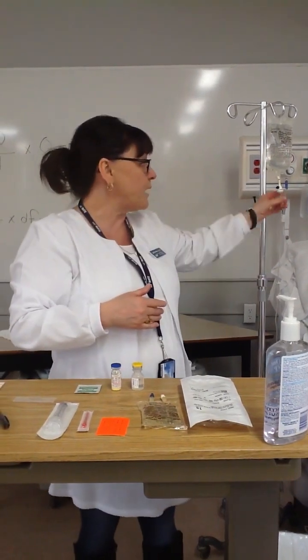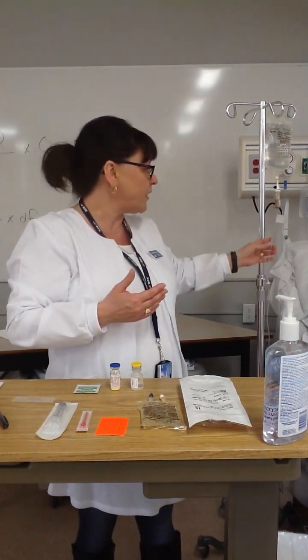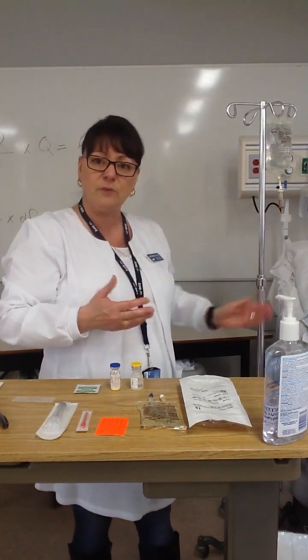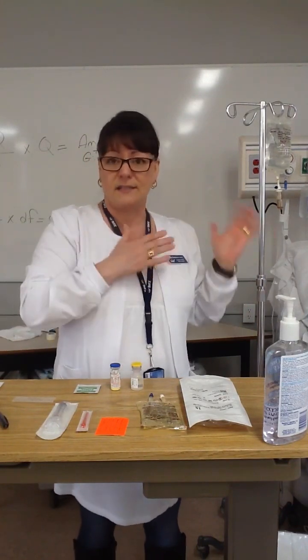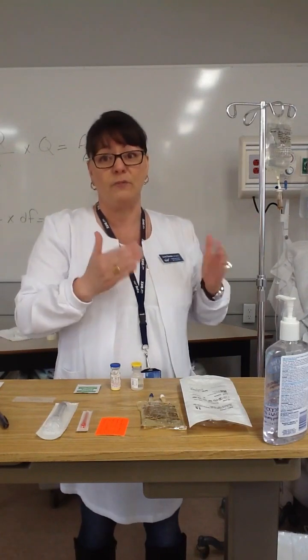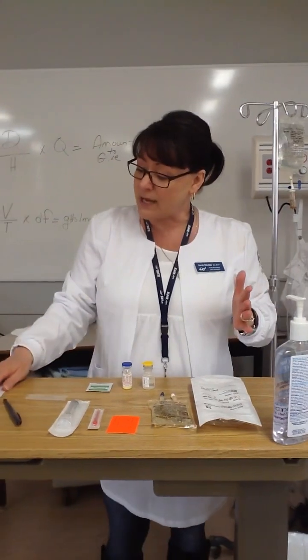Back in the patient's room, I would have checked the tubing again, as you might have seen in some of my other videos. It's very important for us to label the tubing when we initiate it, so that the life of that tubing is clearly labeled and we know when we should change it. That also protects our patient. So I have all my supplies here.